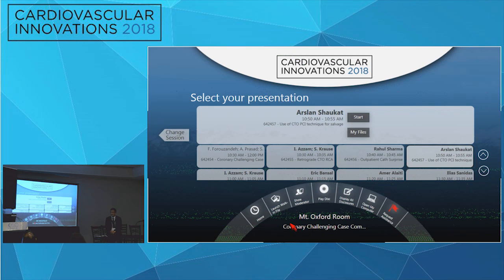Yeah, I agree. The few times that I've used it or scrubbed into those cases, I think it works well because it helps track the wire, sort of, like you said, sucks it in that way, and it worked. And I think the other thing that commonly happens is that you tend to undersize your balloon when you're doing a reverse CART, so I think an appropriately sized balloon also helps. If it's undersized, you can keep trying over and over and it won't work.